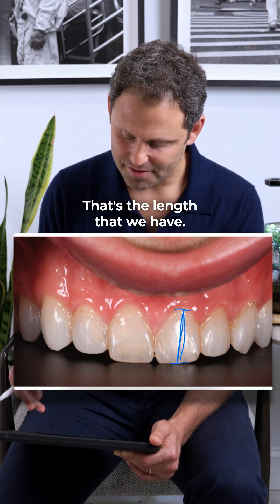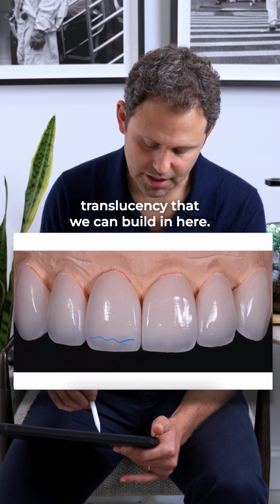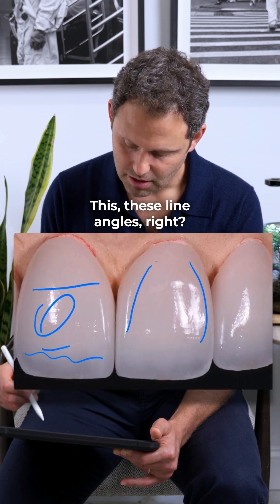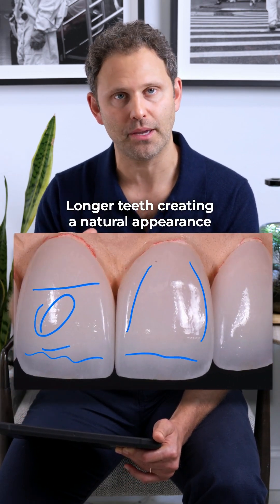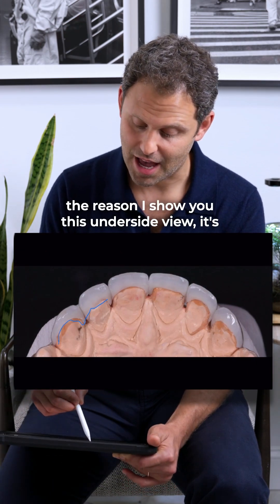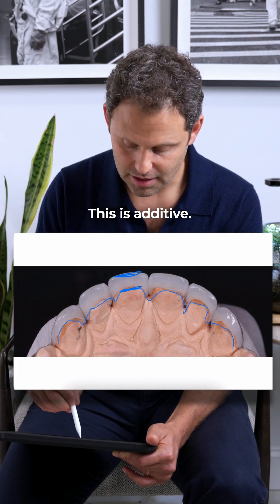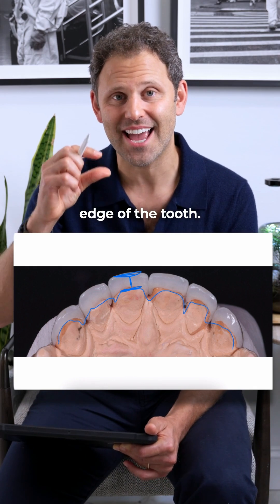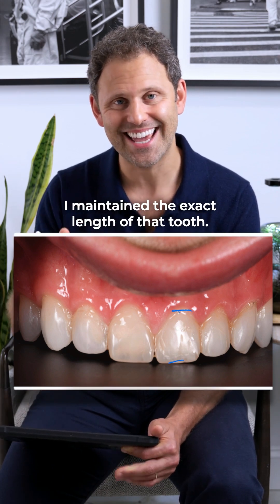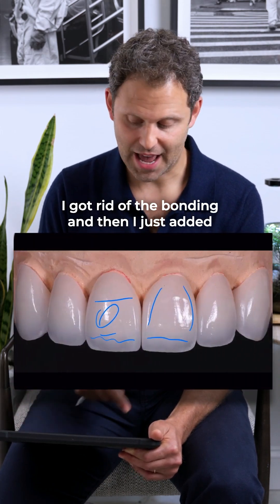For somebody this tall to have such a small tooth and also a heavy lip, it takes some real cosmetic work to get this done. Look at the veneers here — the translucency we can build in, the brightness, the nice pop in the body, the line angles, the longer teeth creating a natural appearance. This is an underside view, and it's really important: this porcelain is completely additive. That means I didn't shave the edge of the tooth — I maintained the exact length, cleaned out the bonding, and just added porcelain.